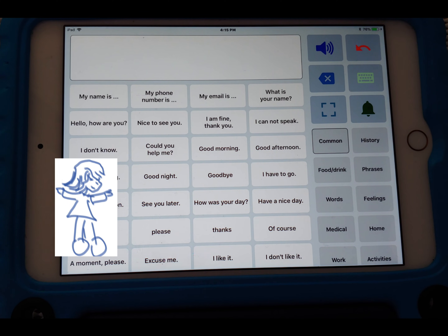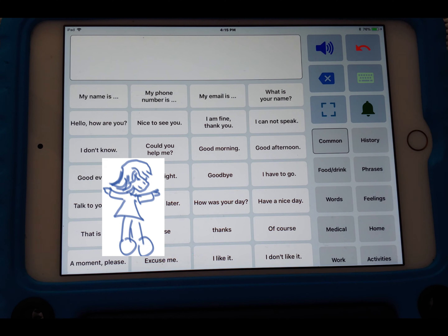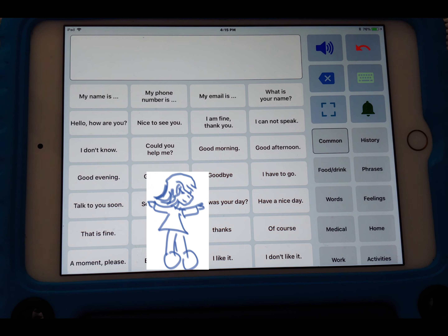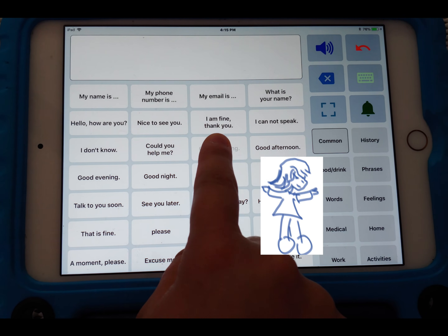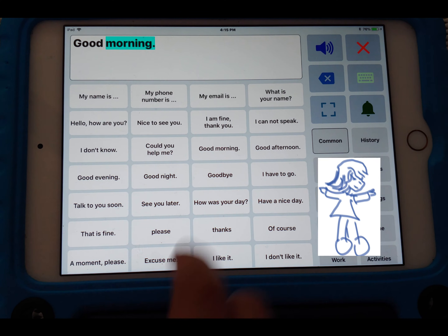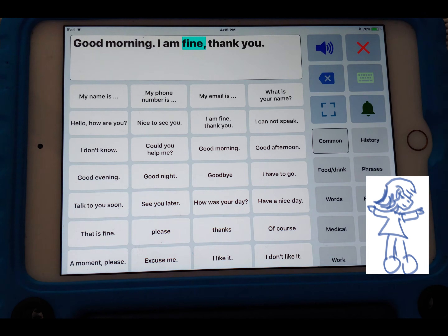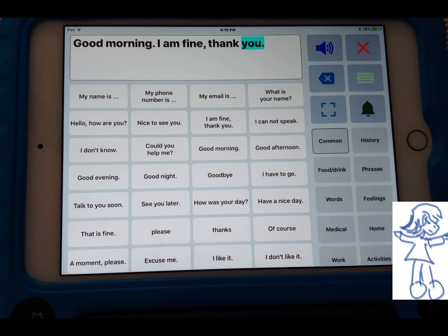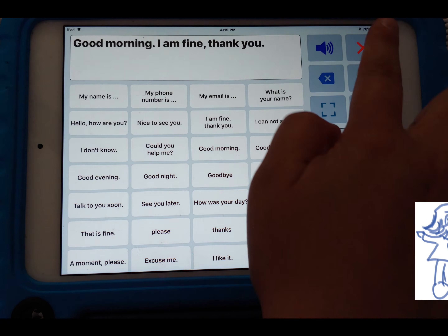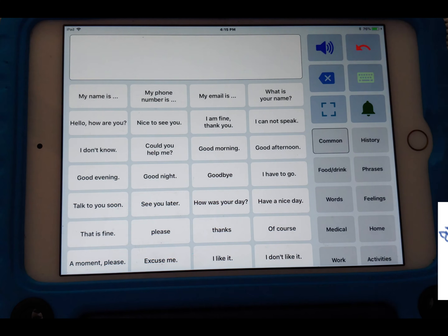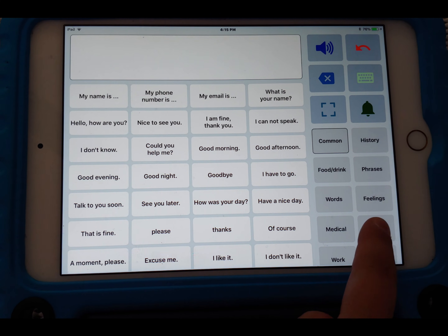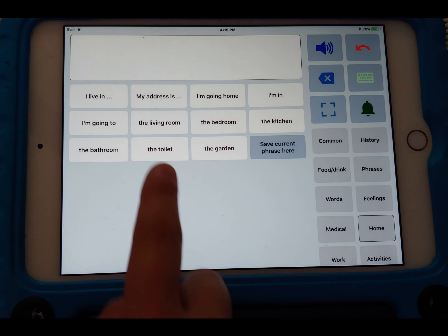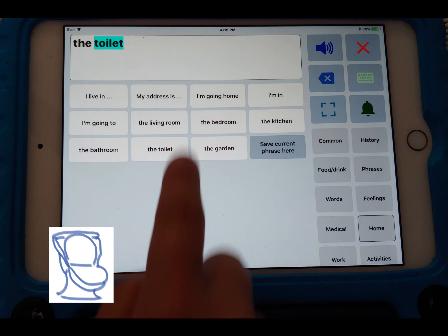Here's a live demonstration of a conversation using the app. The device says: 'Hey, it's great to finally meet you. How are you doing today?' The response typed and played back is: 'Good morning, I am fine, thank you.' Then: 'Before we get started, may I use your bathroom please?' And the device plays: 'The toilet.'